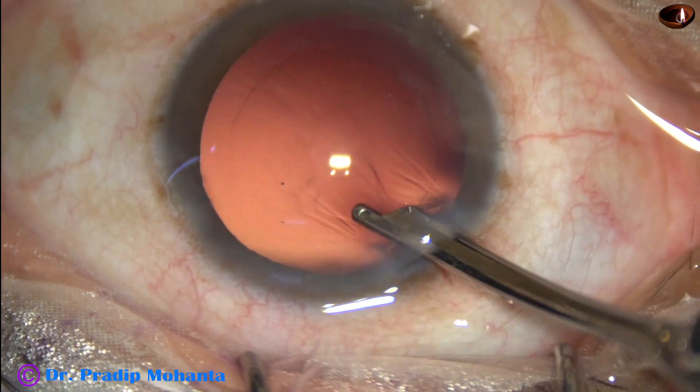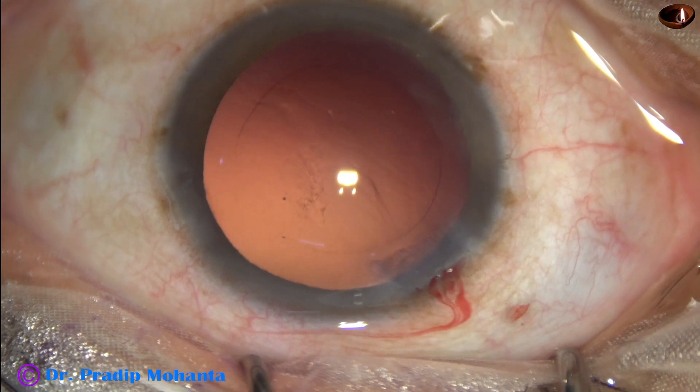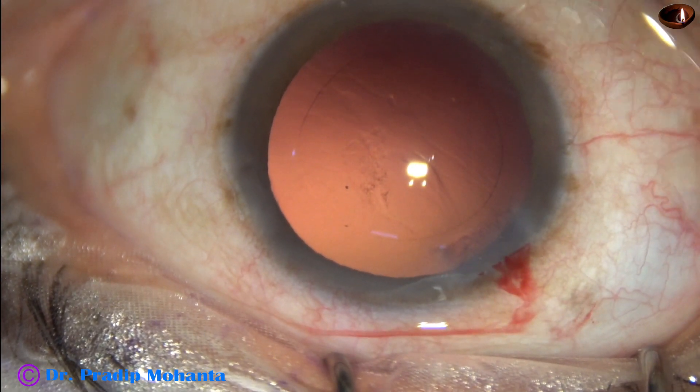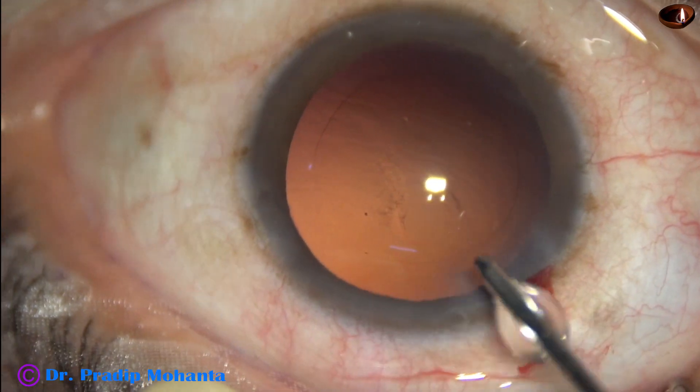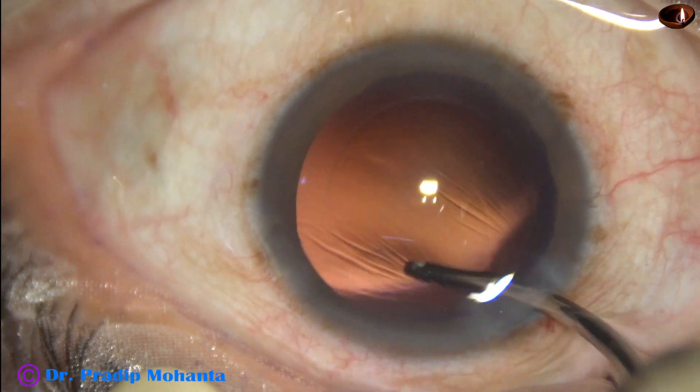This is a very safe instrument and I use it in many situations. Now the posterior capsule is polished by the irrigating jet of fluid.